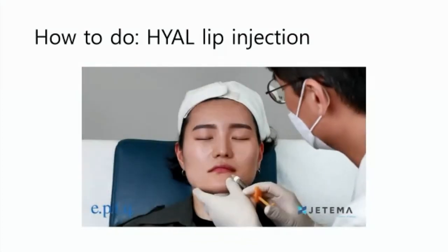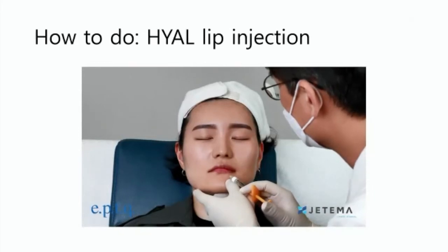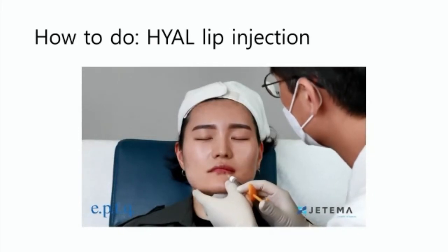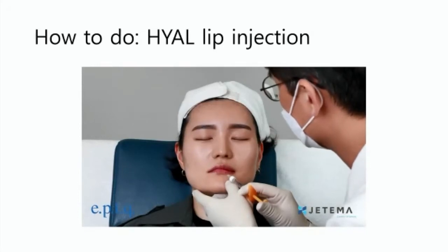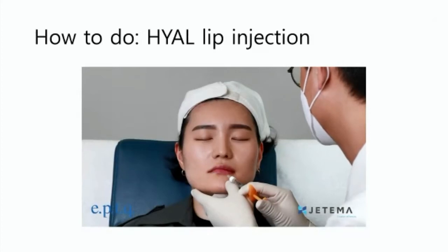So just consider the amount to check how much volume you inject. The second injection is the other side of the lower tubercle augmentation, using the same volume of filler.